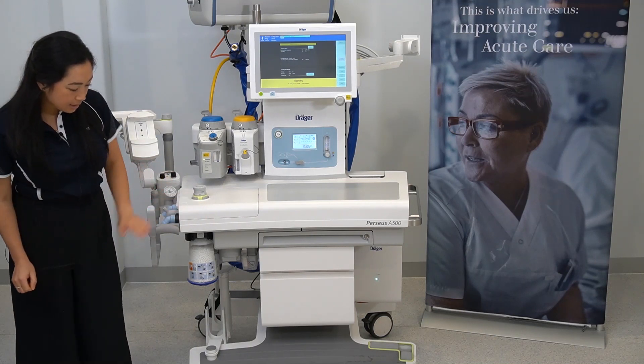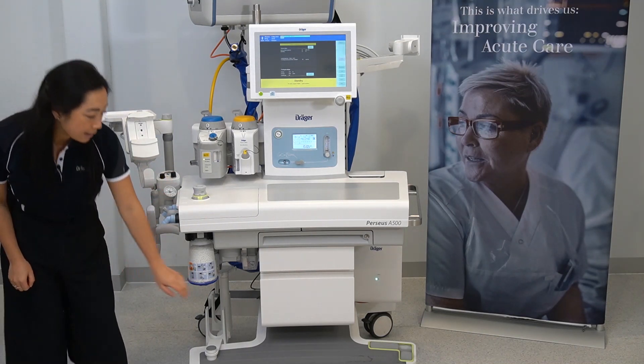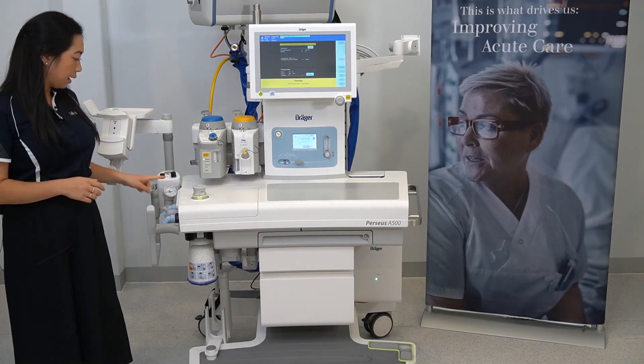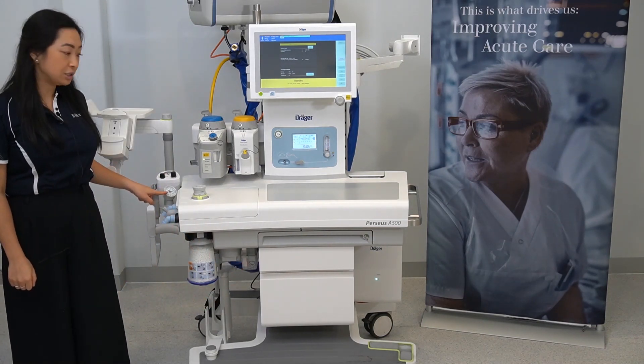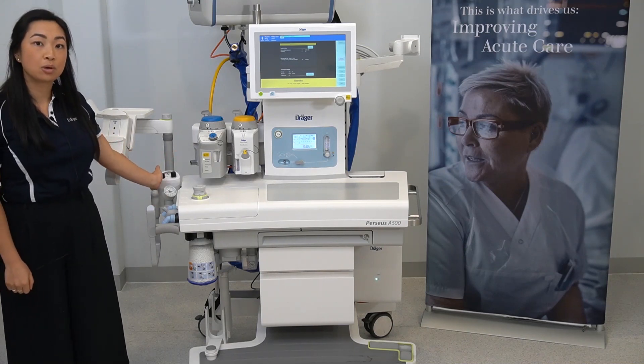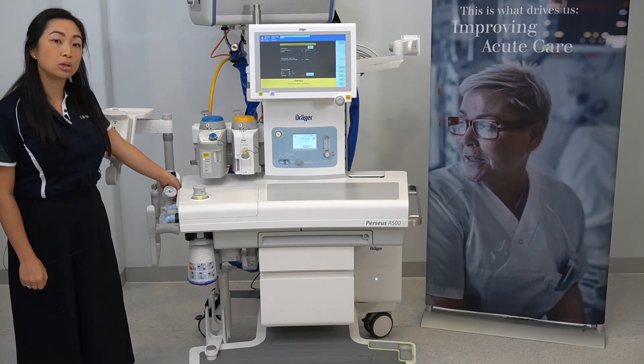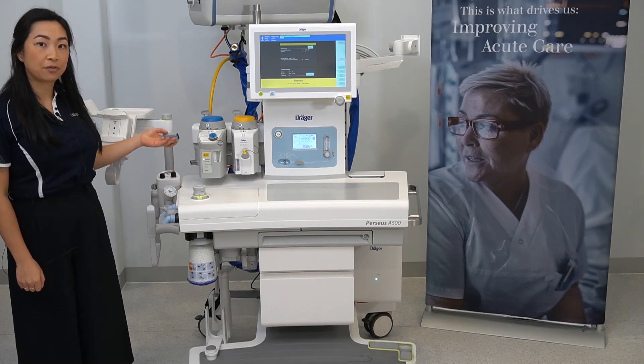On the underside of the breathing block is your soda lime, and next to that you can view your anaesthetic gas scavenging system. This is your manual pressure gauge. Some devices will come with an integrated suctioning device, and the water trap is located in front of the suction.